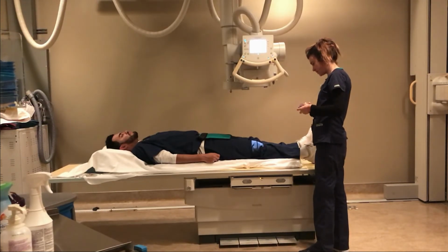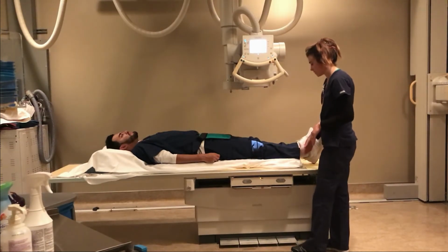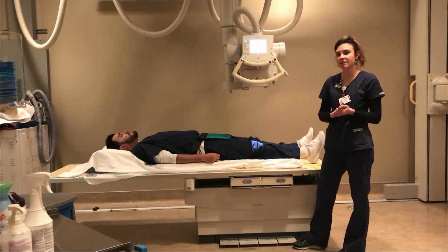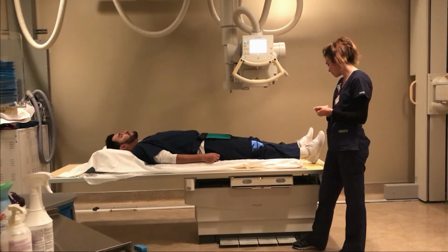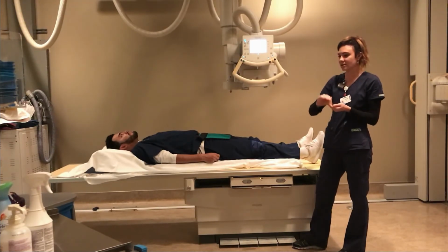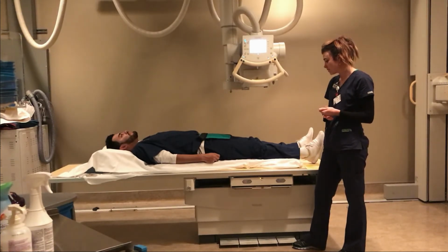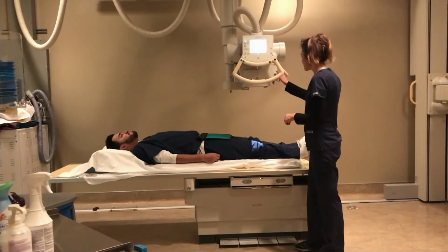This is his right knee. So for this projection, as well as the other 3 projections of the knee, I would be using, according to Merrill's, a technique of 85 kVp and 2.5 mAs. For the AP projection, I won't be using a tube angle on Phil just because the distance between his ASIS and the table is greater than 19 centimeters and less than 25. So this one looks good. There's no breathing technique.